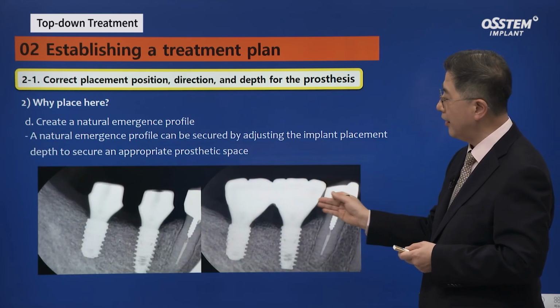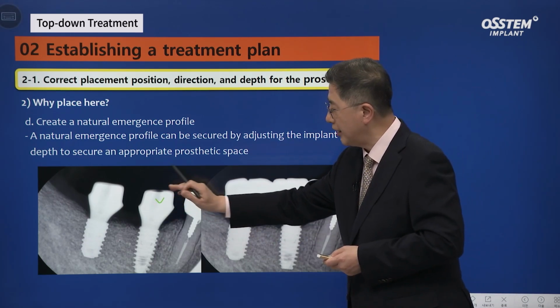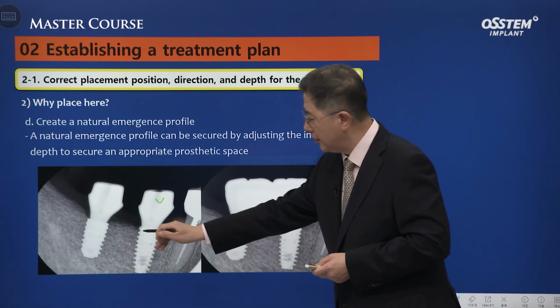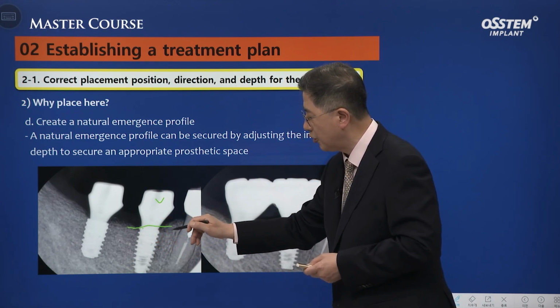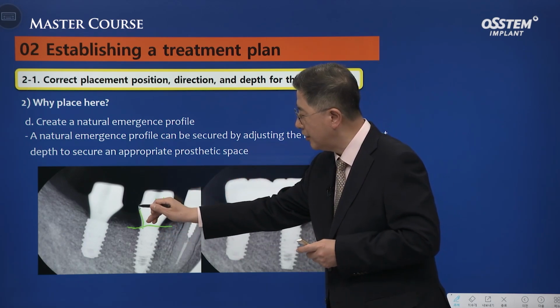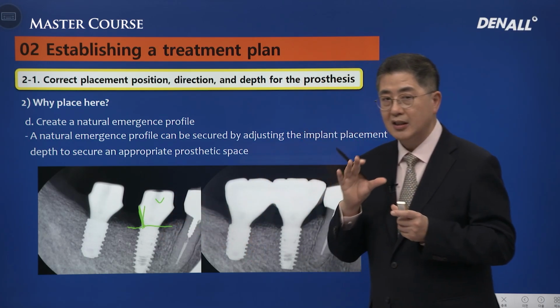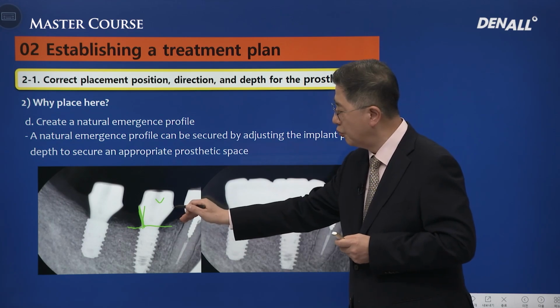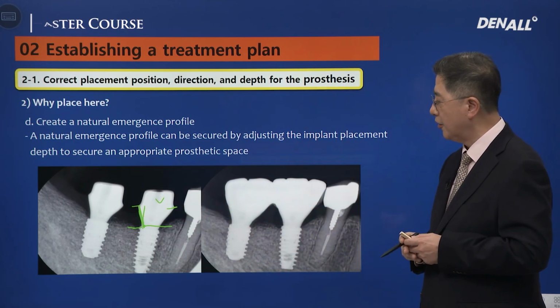This is a clinical photo that I took. This is CAD-CAM abutment and final prosthesis. You can see there's slight bone loss, but mostly it has been placed deep in the bone. The abutment margins, angles, and heights I use are quite significant, and the cuff height is approximately 4 to 5 millimeters. And I choose supra margin, and that is how I fabricate prosthesis.